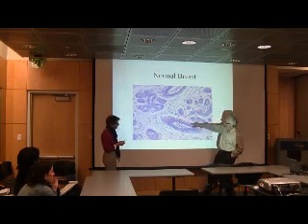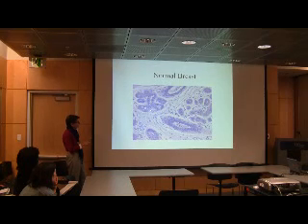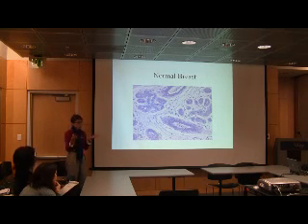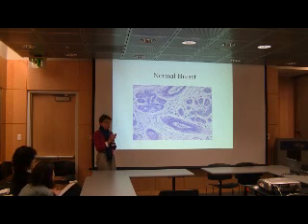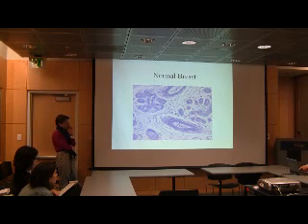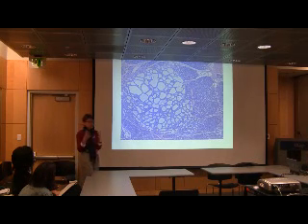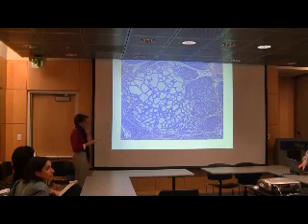I have a better picture, we'll be coming to it in a minute. But that's true for the lobules: they have two layers of cells, and there should be a little bit of an opening in the center of these structures. That is normal. If it's not there, then something is going on that's not totally normal, and we'll look at that as well as we go forward. There will be a lot more of this. And the other thing is that there's lots of variability, and I'll show you some more examples of what's normal, and they don't all look exactly the same, because there is variability between people.